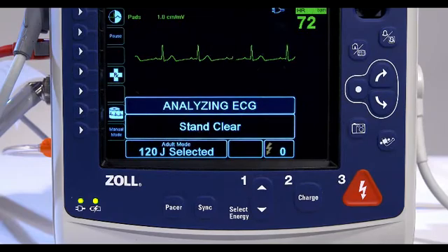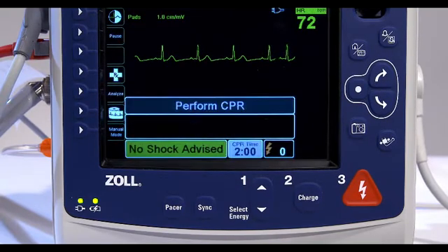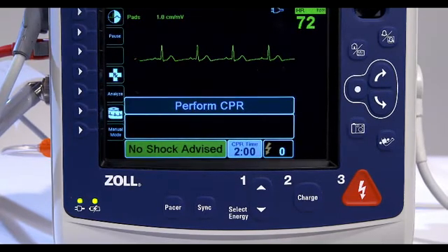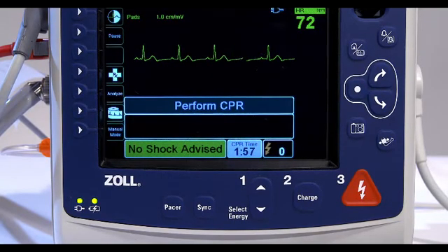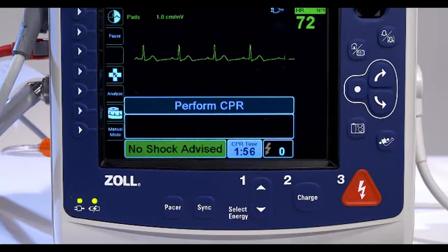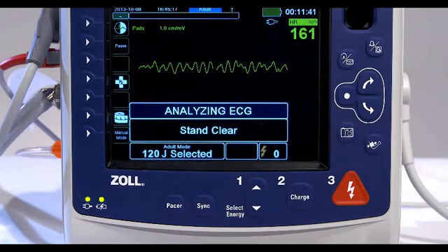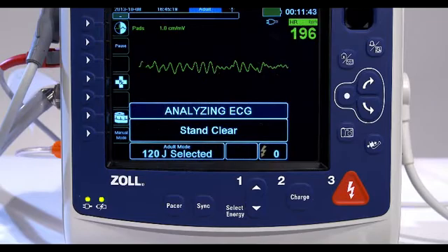When a non-shockable rhythm is detected, the unit displays a No Shock Advised message. Immediately begin chest compressions and continue other treatment per protocol.